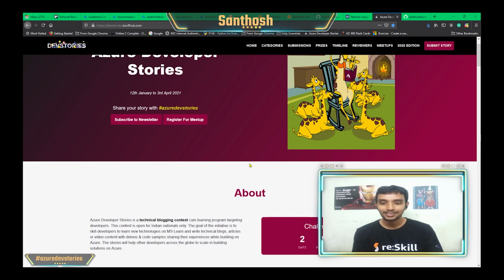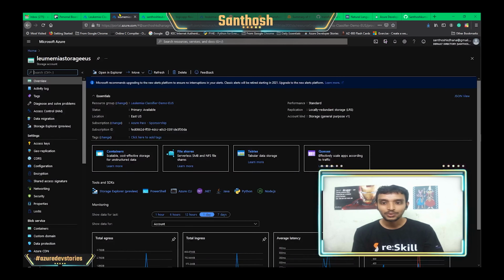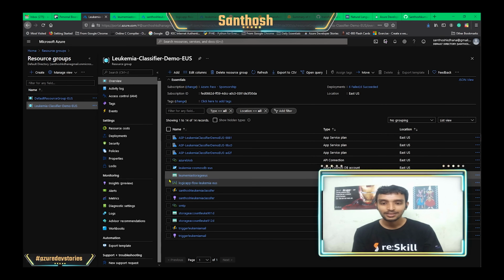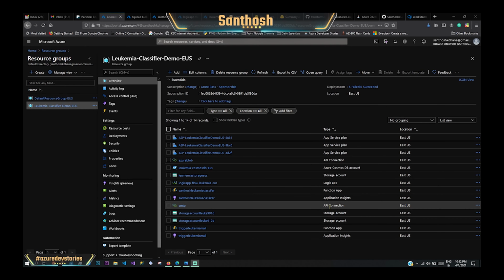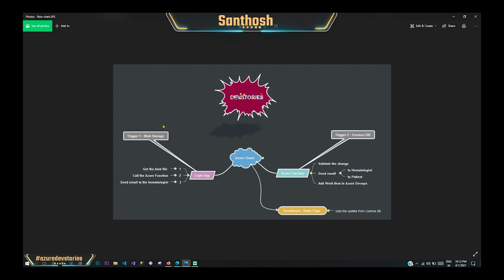So let's get started then. Let me just go to my resources page. I'll walk you through the various resources that I have used. So let's start our demo then. Let me just pull up this image to walk you through the entire process.